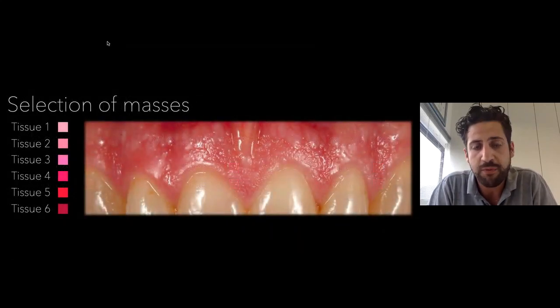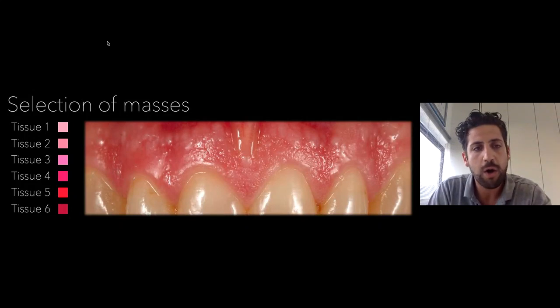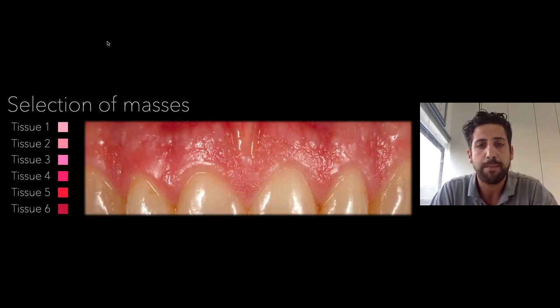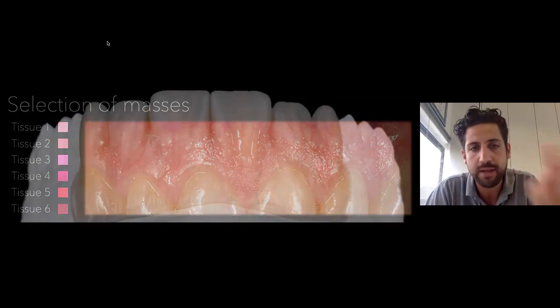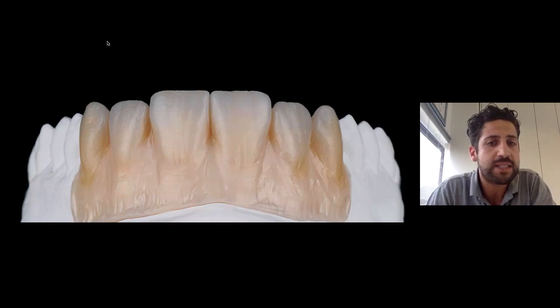Selection of the masses. For example, in this picture, it's a natural gingiva, and we can see all 6 colors around the gingiva. All 6 are present in this kind of natural gingiva. But it's really important to make the distinction of the space, where every mass goes. Okay, let's see the protocol.